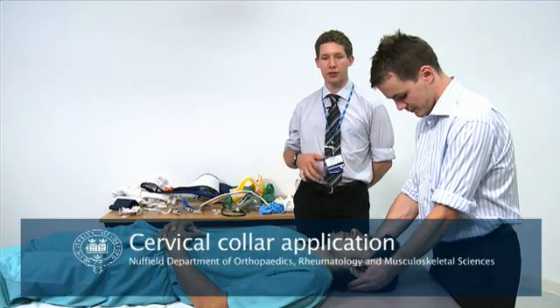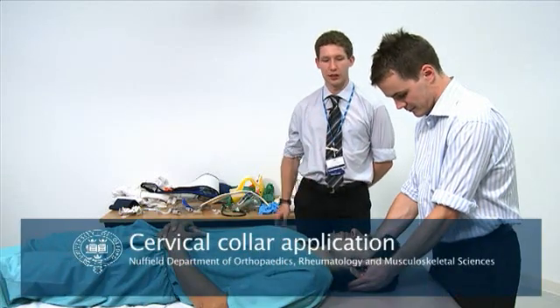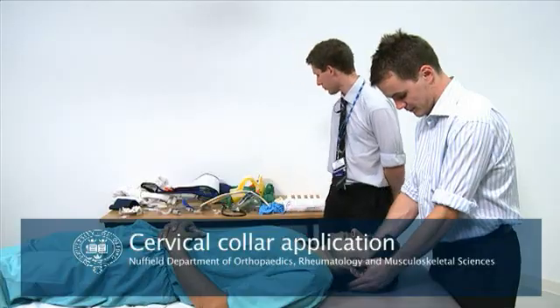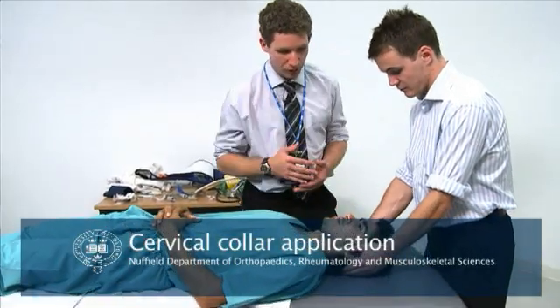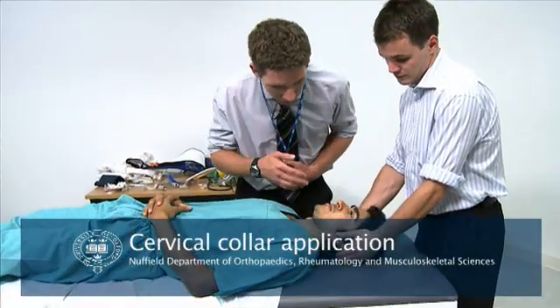This video is going to show you how to apply a cervical collar to an unconscious patient. We begin by sizing the collar with the cervical spine secured by somebody else.